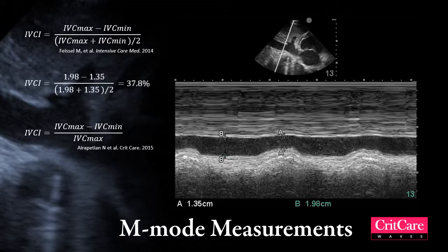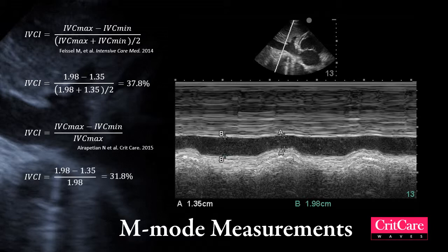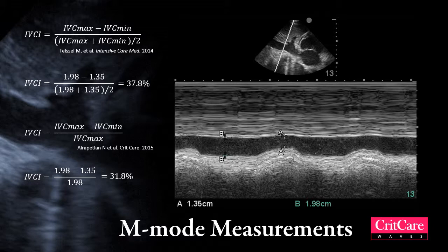There are two different equations, and depending which one you use, you can calculate a percentage of collapse or distensibility, and you can use this to measure right atrial pressure. This is useful when you're trying to figure out if you want to give a patient fluids or start other therapies such as vasopressor medications.